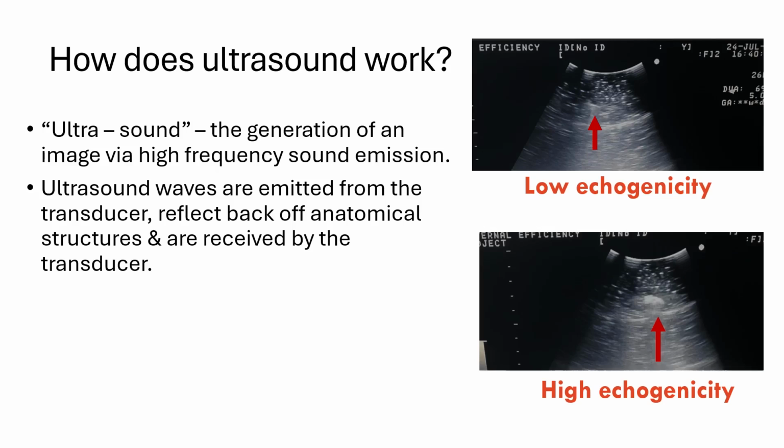So ultrasound works exactly how it sounds like. Ultrasound. It's a generation of an image via a high-frequency sound emission. Your transducer emits these high-frequency ultrasound waves. These reflect back off anatomical structures and are received back by the transducer into electrical pulses to create an image on that screen.